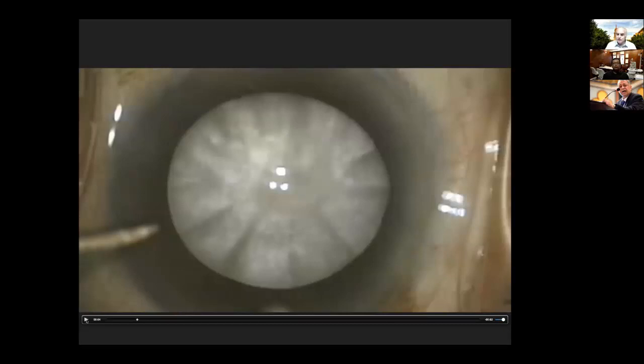And the rules of capsulorhexis are that you have to have a deep anterior chamber. You move every 2 clock hours. You hold near the tearing edge and bring always the flap to the center. And to achieve the idea of all these rules, you want to control it so that there is no vector of forces that affects the direction of the tear.